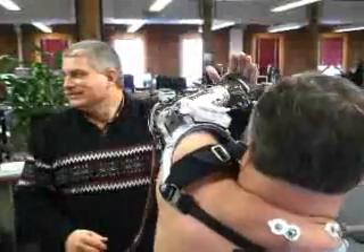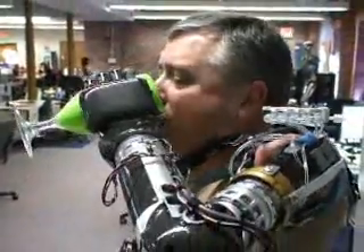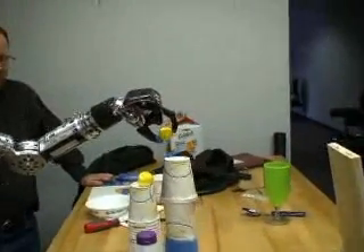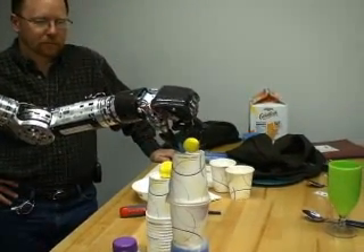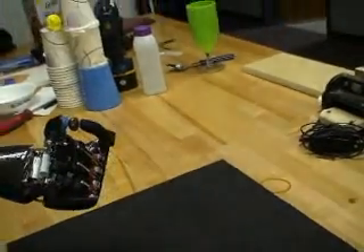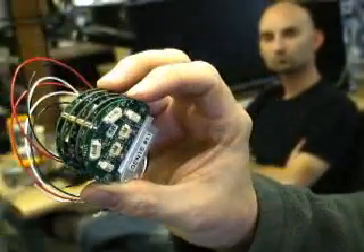The Luke arm also had to be agile enough to do exactly what the human arm can do. So far, the test pilots, within a matter of five to ten hours of practice, can operate the arm such that they can pick up small objects, stack cups, and even eat grapes. The arm handles these complex tasks because of the sophistication of the electronics inside — technologies like lithium batteries and processors have come within reach in the last few years.